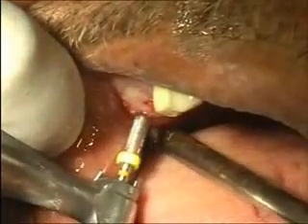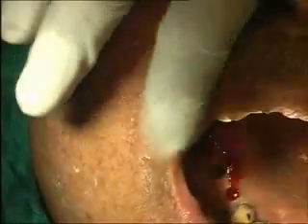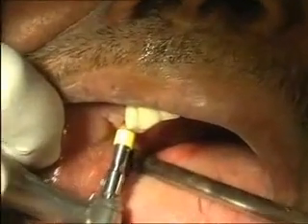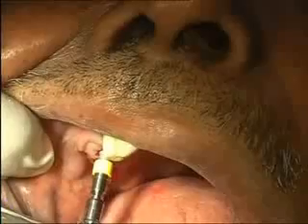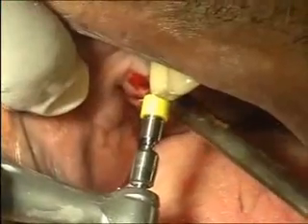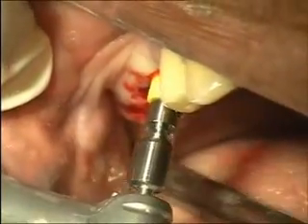There are horizontal markings on the drill — I don't know if you can see from there. It's a must because you are doing an osteotomy. The next process, you will make a motor run. You can see the implant getting inserted as it goes in — it beautifully goes in, you can control it. The first thing that must happen is that the implant must come into contact with the patient's blood. It goes straight after the insertion.